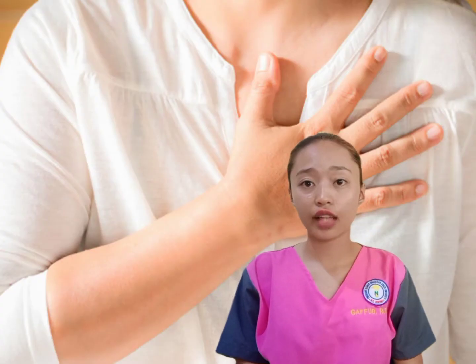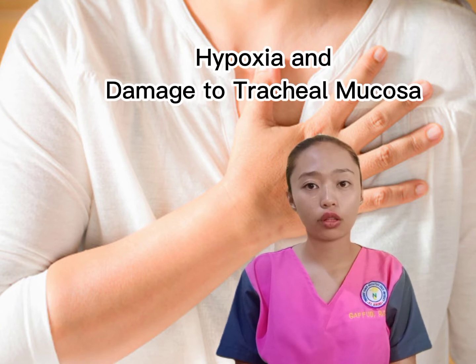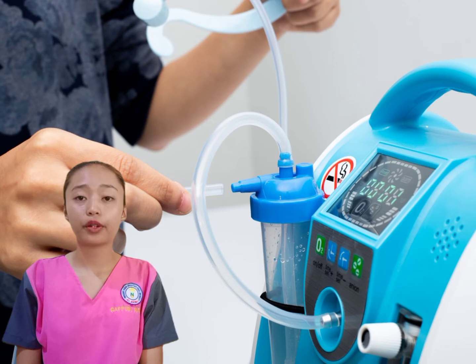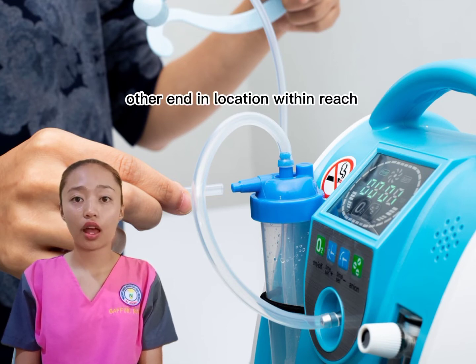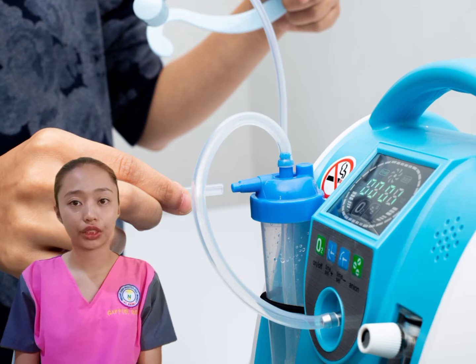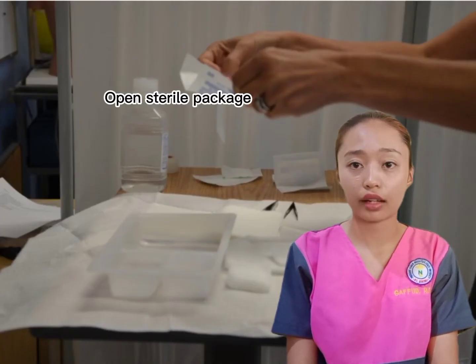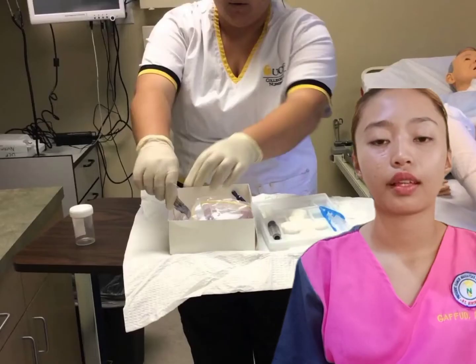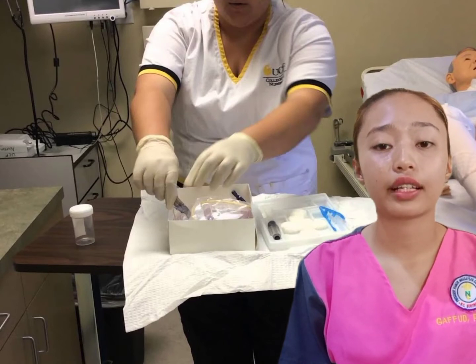Note that significant hypoxia and damage to tracheal mucosa can result from excessive negative pressure. Secure one end of the connecting tube to the suction machine and place the other end in a convenient location within reach. Use an inline suction catheter, or open the sterile package on a clean surface using the inside of the wrapping as a sterile field. Next, prepare the catheter and prevent transmission of microorganisms.